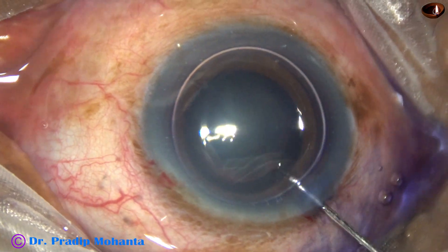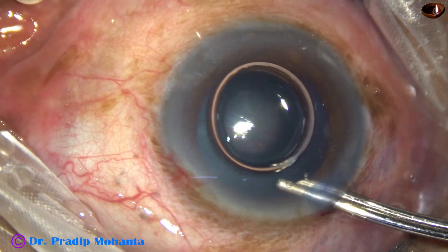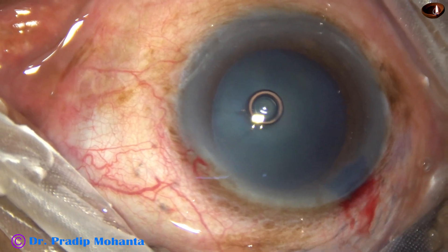I am happy to share the Swiss Phobe intraocular lens in this video. By this time, the main incision has been made and the anterior capsule has been stained with trypan blue dye.